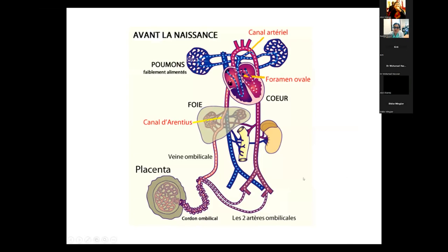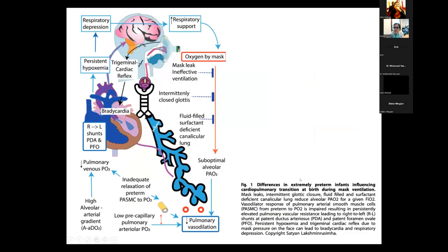And still in the delivery suite, we're not necessarily using point of care ultrasound or lung ultrasound to evaluate what goes on when things don't go well. I think we should, because there's so much that could happen. This is from a paper, and I see I didn't put the reference here. It came out in 2022. I think the last author is Patrick McNamara, I think.